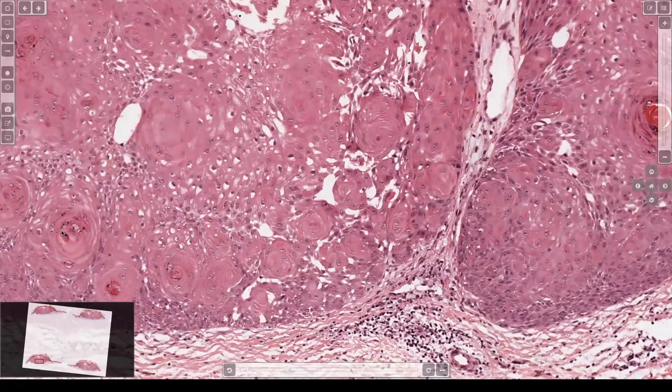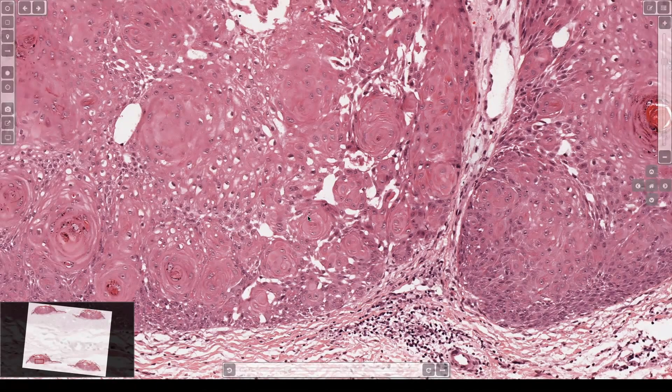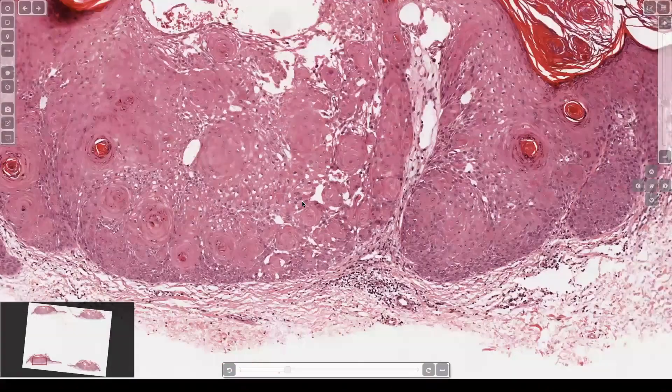And then we got these squamous eddies, these beautiful swirls and whirls of bright pink keratin, and they're not invading down into the dermis. So I think there's two different considerations when you see this pattern.